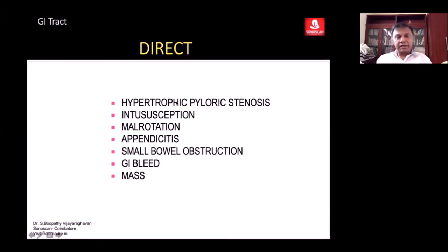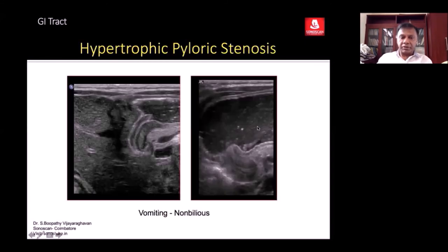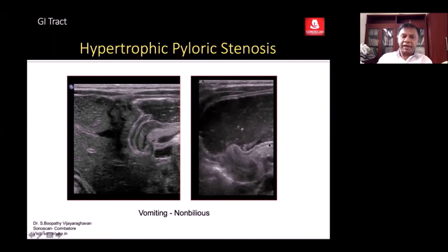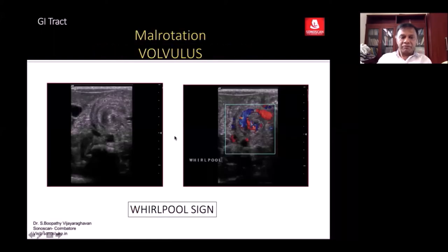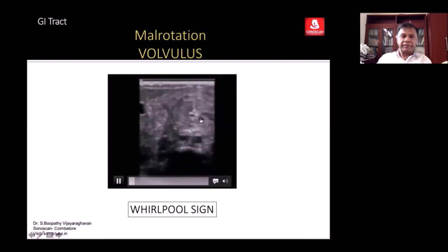The clinical reference may be hypertrophic pyloric stenosis (HPS). When HPS is clinically suspected, you must feed the child and then do the scan. On high-frequency scanning, you see the aorta, IVC, the superior mesenteric artery anterior to the aorta, and to the right of the superior mesenteric artery you see the sign of volvulus — both on grayscale and color Doppler — and in real time you see the whirlpool sign.